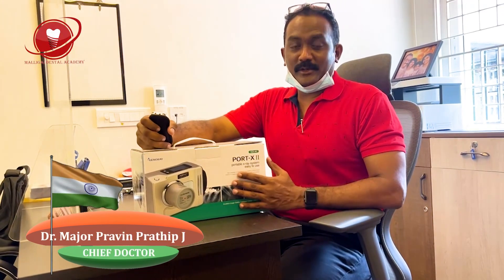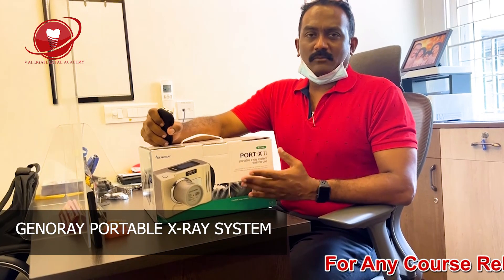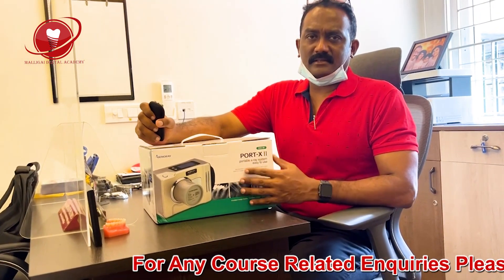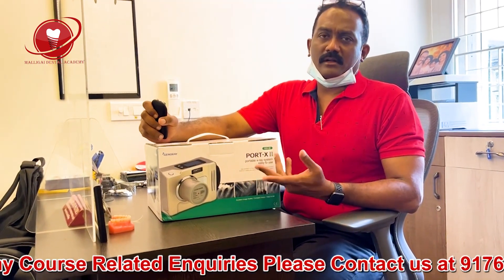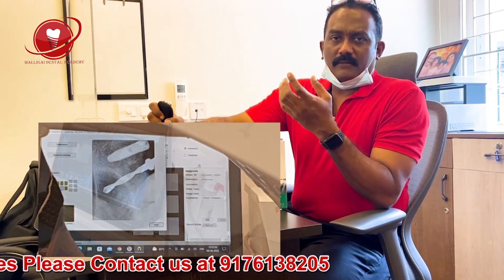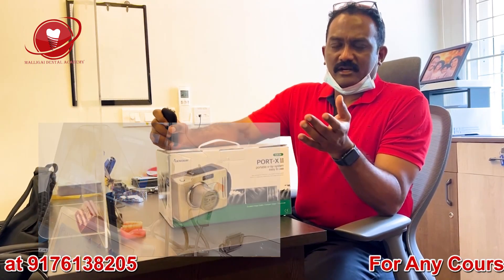Hello viewers! Today I am going to show you the unboxing of this GenoRay portable X-ray machine. Most of you will be having multiple practices, multiple chairs in a practice. For people who have more than one dental chair, if you fix the X-ray machine in the wall, it's going to be very difficult to move the patient from one chair to the other.